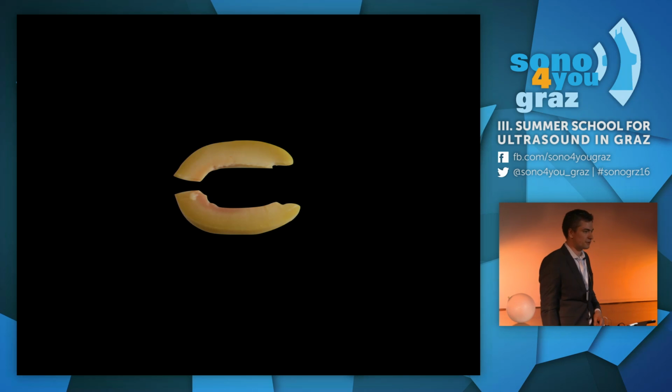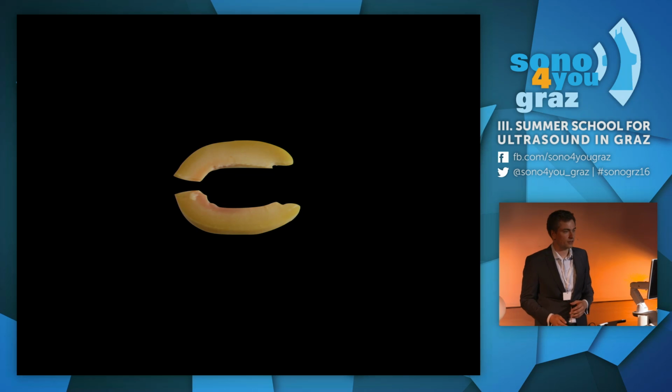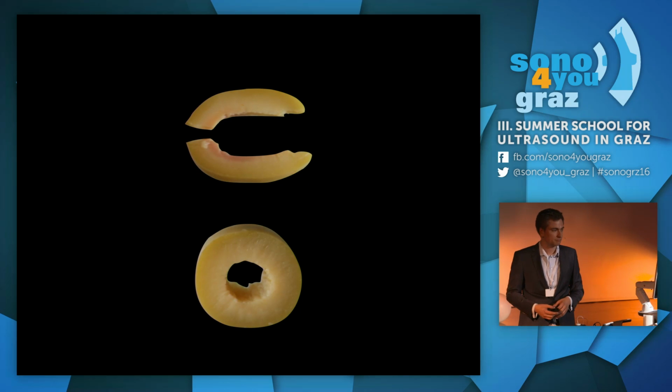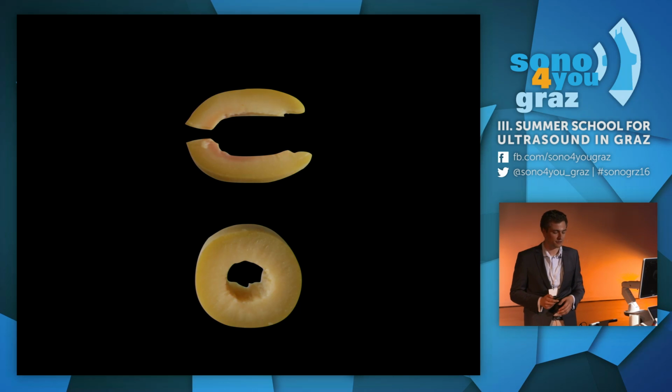So in the first place, we have seen something like this. And it's really difficult to tell this is an olive. And we looked like we did in the cucumber. A second plane, it looked like this. And it's still not feasible to actually tell this is an olive.